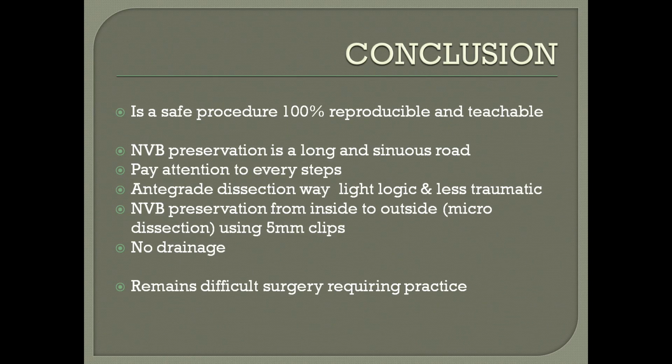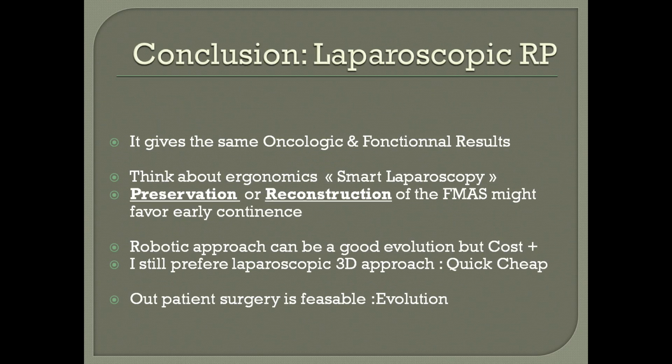It remains difficult if you don't practice it. So I'm doing prostatectomy every week. It gives for me the same oncologic result comparing to the robotic and to the open when the guys are doing very well. So think of the ergonomy. If you can sit on a saddle, you have a table going really down, never work like this. It's impossible. You should be comfortable. I think 3D is very important.